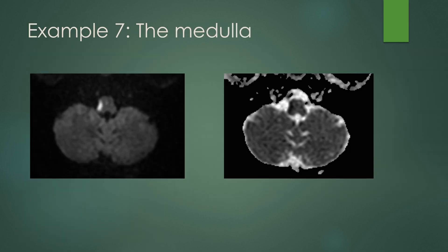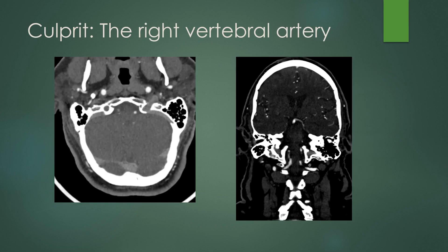Example seven is the medulla. You can have an area of restricted diffusion in the lateral medulla — bright on DWI, dark on ADC. CT is not shown because it is very difficult to see on CT. On vascular imaging, there is severe stenosis of the right V4 segment; you can see the V3 segment going to the V4 intracranially, then an abrupt caliber change of that right vertebral artery, which was the cause of a lateral medullary infarct.